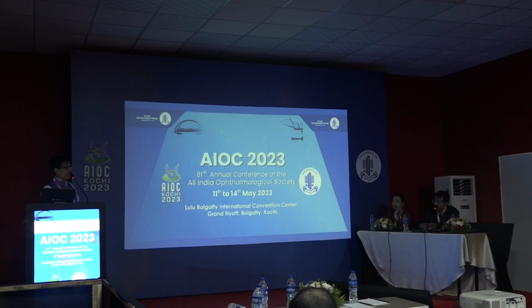Am I correct? Yeah, definitely. Like one eye emmetropia and the other, non-dominant eye, a 0.5 to 0.75 myopia if you make, then the patient can see distance as well as read. They'll be very happy actually. I am myopic. I am reading without glasses.